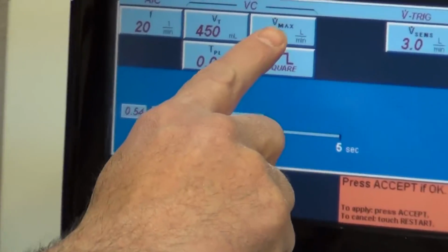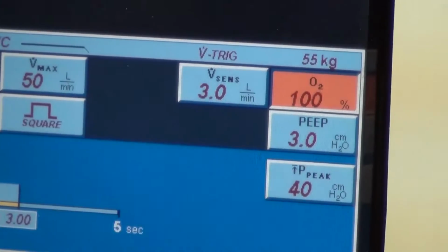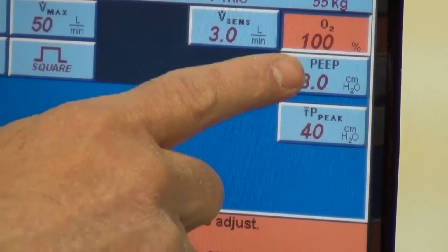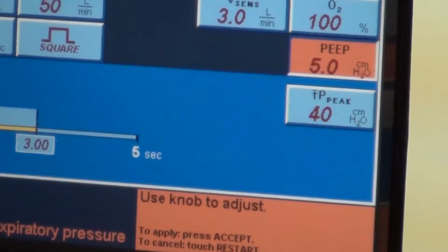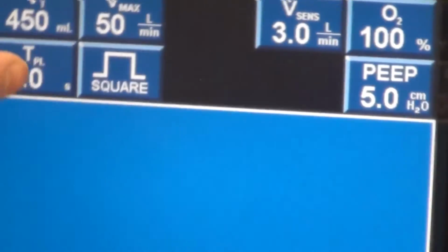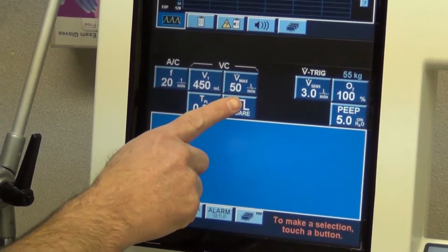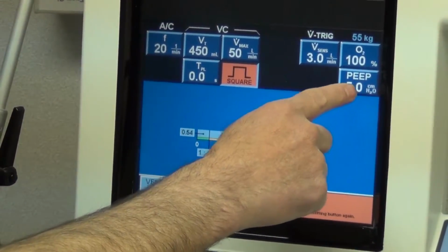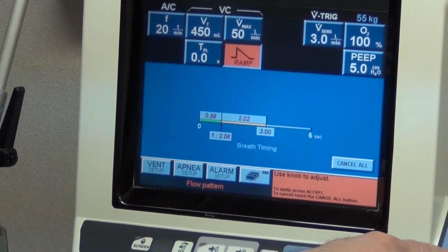The next thing you want to change, let's say the doctor gave you, always typically start with 100% when you initially ventilate somebody and then wean down quickly. PEEP, let's say the doctor told us 5 of PEEP, we'll set that. And notice I hit that accept button. Notice how I brought it up. Oh no, I wasn't done setting it yet. Well, you could still make changes here. So we'll hit this one next. This one never changes, and we've already made all the other changes. This one is, we always want it in ramp.